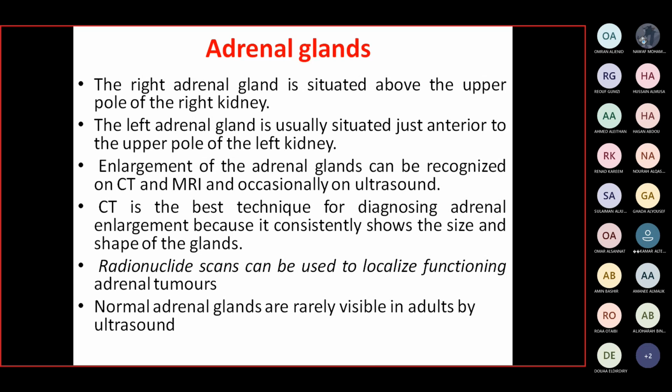Nuclear medicine can also be used to localize a functioning adrenal tumor. Note that radionuclide or nuclear medicine usually demonstrates the function rather than the anatomy. So the function of the adrenal gland can be assessed by radionuclide or scintigraphy.